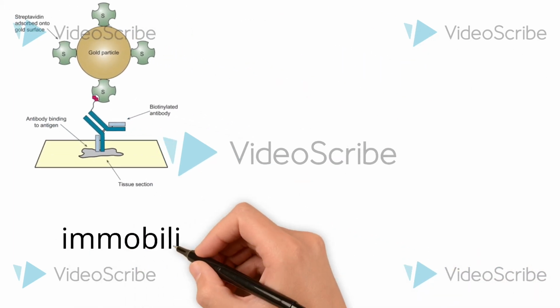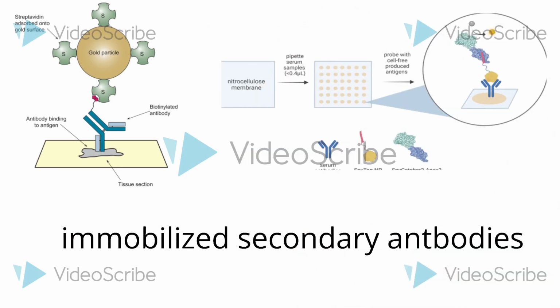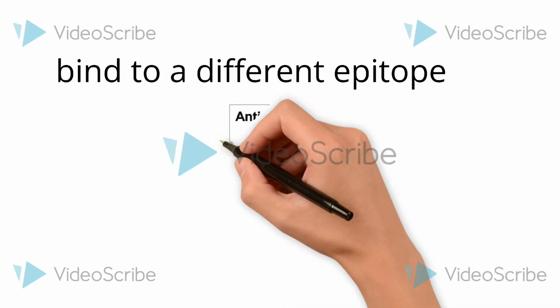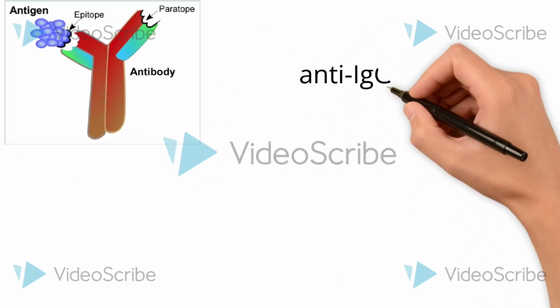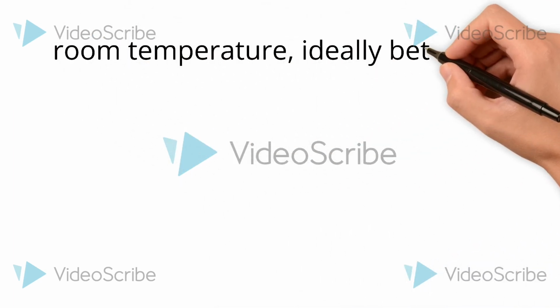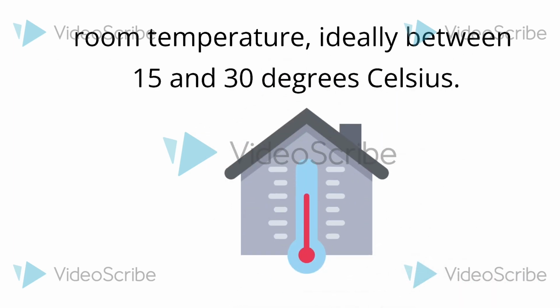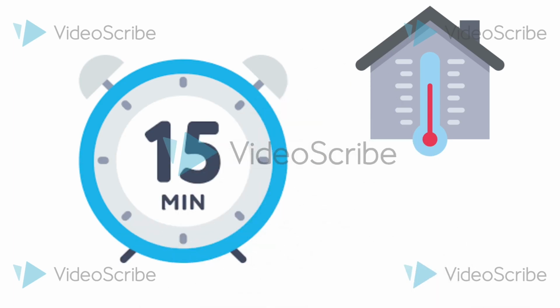This immune complex continues migrating toward the test line, which contains immobilized secondary antibodies that also recognize diphtheria toxin but bind to a different epitope. As the liquid continues to migrate, it reaches the control line, which contains anti-IgG antibodies. These antibodies bind to the gold-labeled antibodies. The test should be done at room temperature, between 15 and 30 degrees Celsius. After applying the sample, you have to wait about 15 to 20 minutes before reading the results.